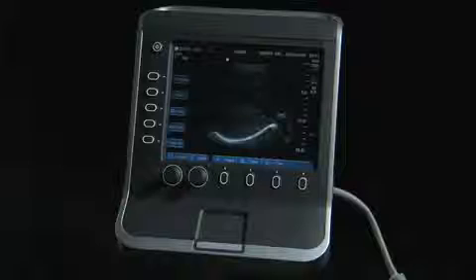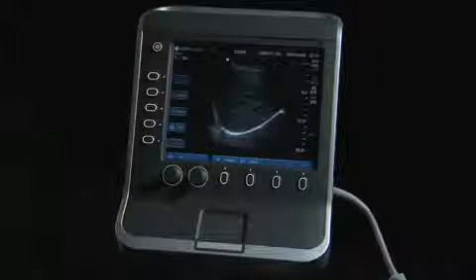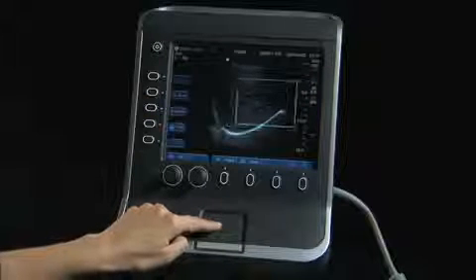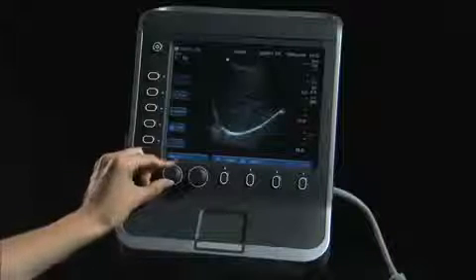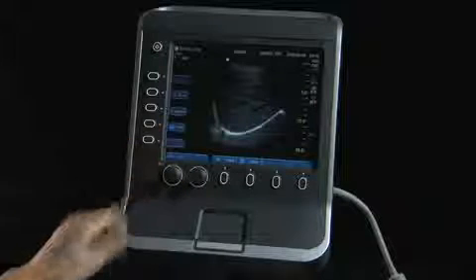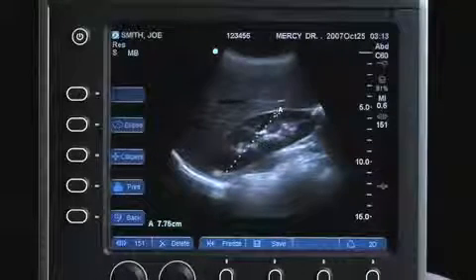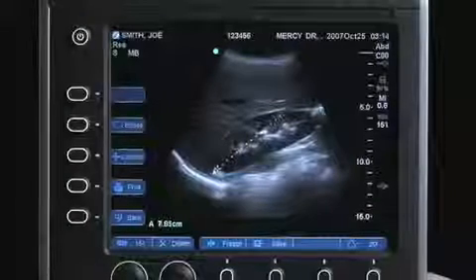When the ultrasound image is frozen, there are several features available to optimize the image. The image can be zoomed to clearly identify a structure of interest, or other frames may be selected by scrolling through the cine buffer. Once the image is optimized, structures can be measured by selecting calipers. The generic caliper button activates up to 8 sets of calipers on the screen. From this menu, area measurements may also be selected.